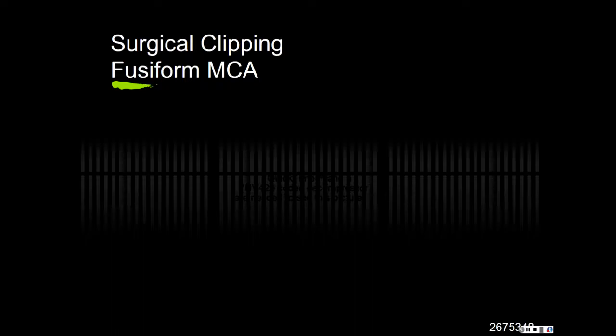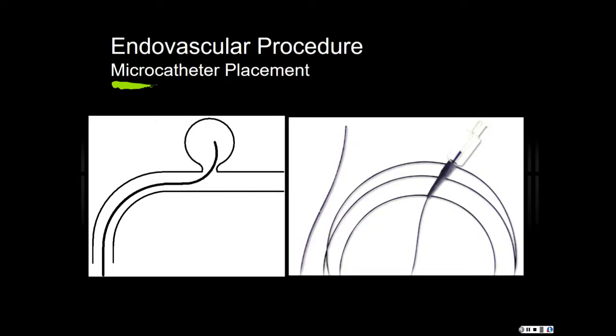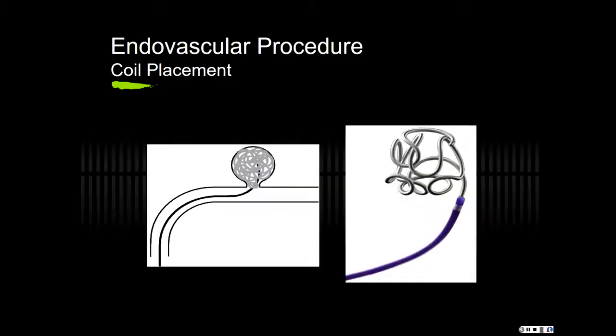So when coiling aneurysms, you deliver a wire-shaped device that goes inside of the aneurysm, and you deliver this coil until the entire aneurysm is isolated from the blood supply. And then that patient is presumably protected for years and years. The aneurysm won't rupture again. It won't continue to get large. That's endovascularly, and that's what it looks like.